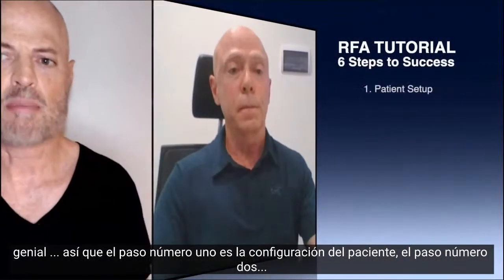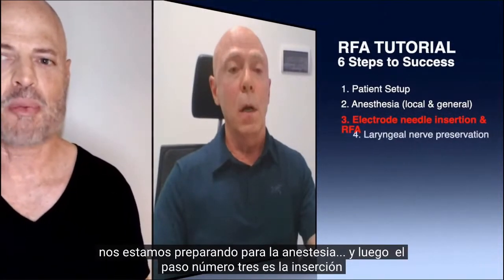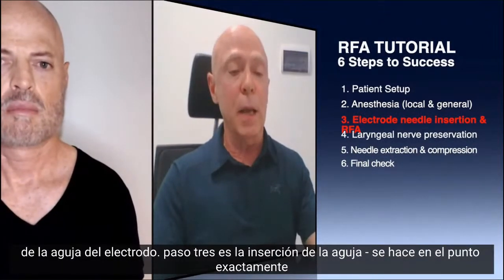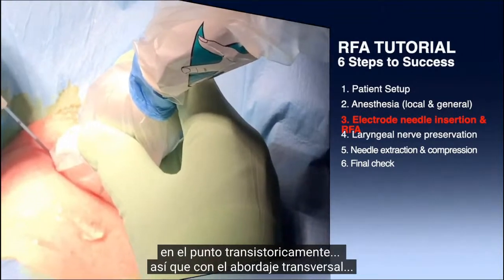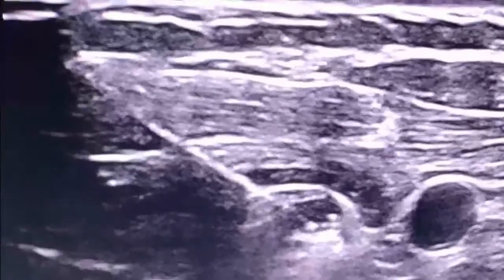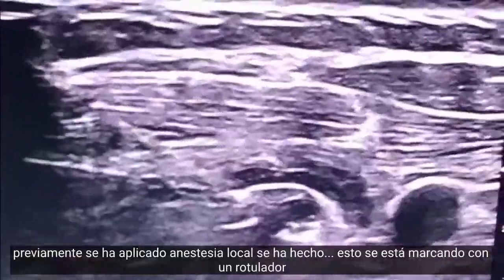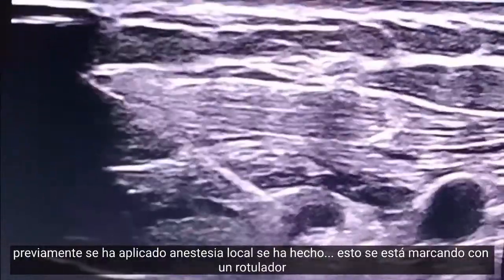Great. So step number 1 is the patient setup. Step number 2, we're preparing for anesthesia. And then step number 3 is the electrode needle insertion. Step 3 is insertion of the needle. It is done with a transisthmic, transverse approach, exactly at the point where previously local anesthesia has been done. This is marked with a marker pen.